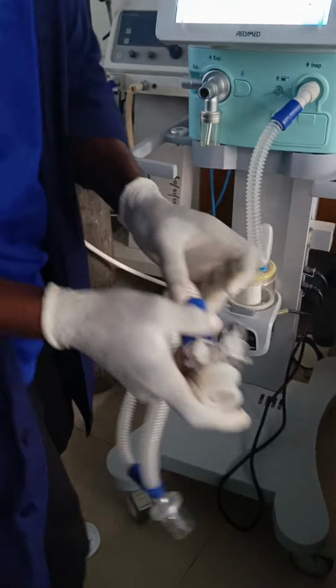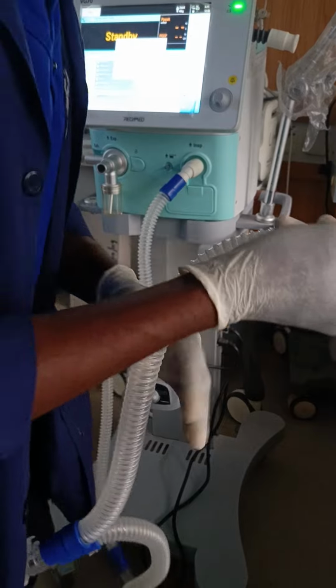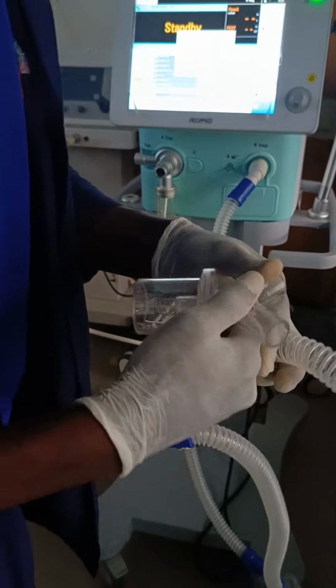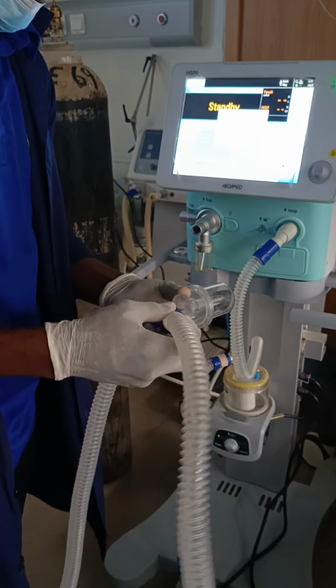So this is for the inspiratory aspect. Then the expiratory limb goes back to the water trap and back to the expiratory port.